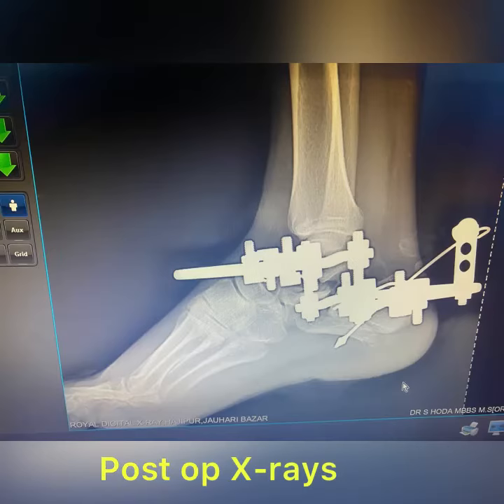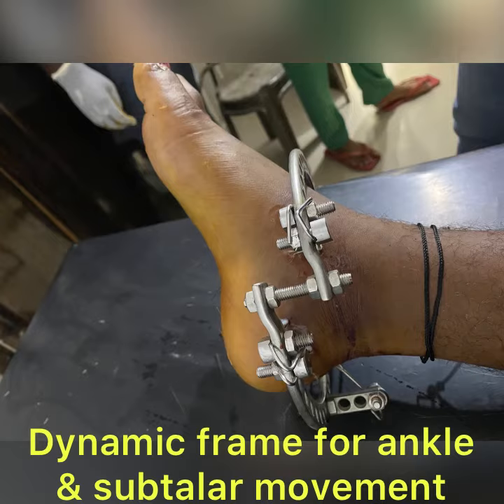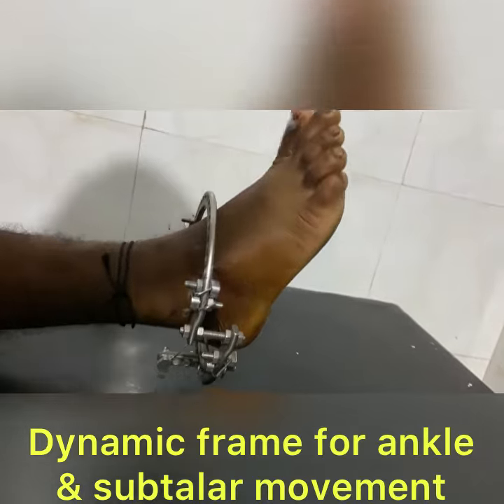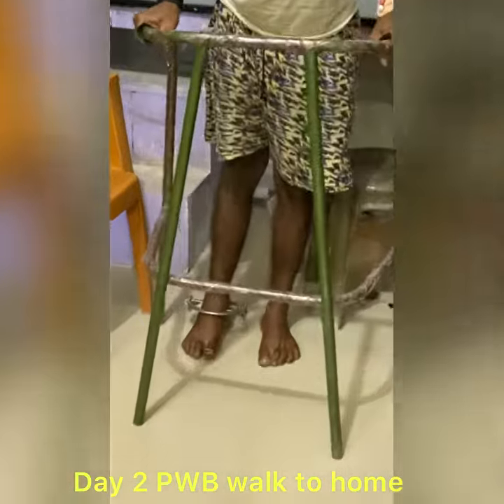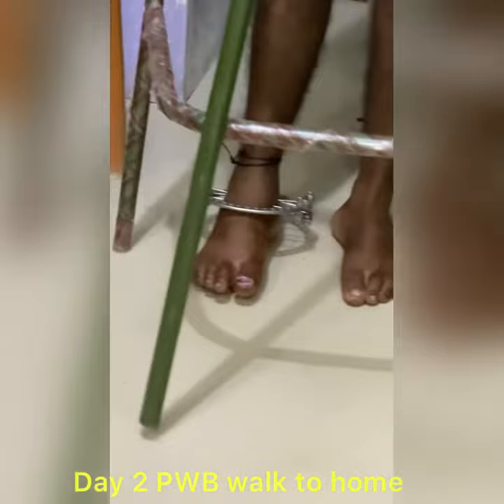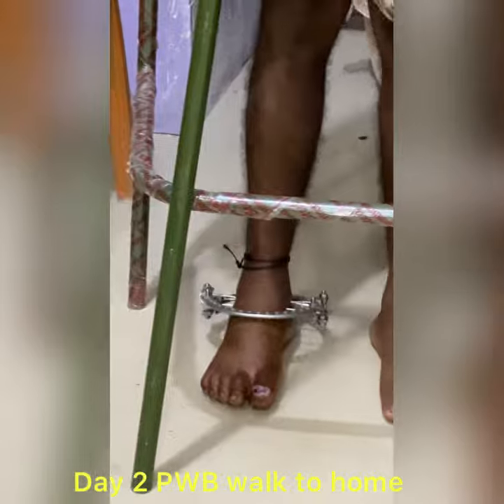Here the full movements are allowed. There is no joint arthrosis post-op, as you will see in the x-rays. This is the first post-op dressing day. Free movement is there. You can see the bar maintains the arch through the ligamentotaxis. The patient is allowed to walk partially with a comfortable weight.